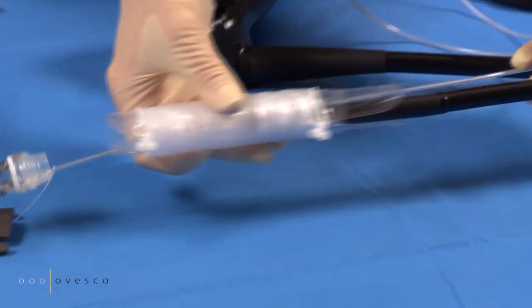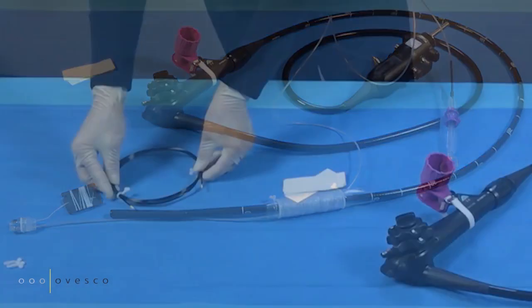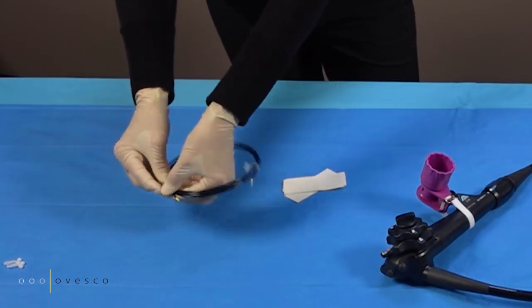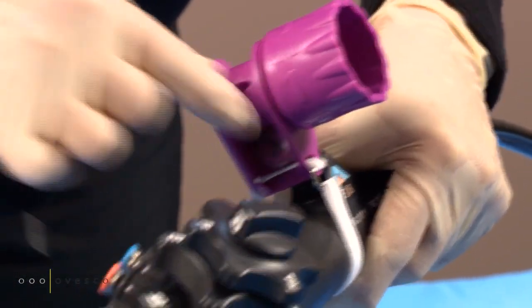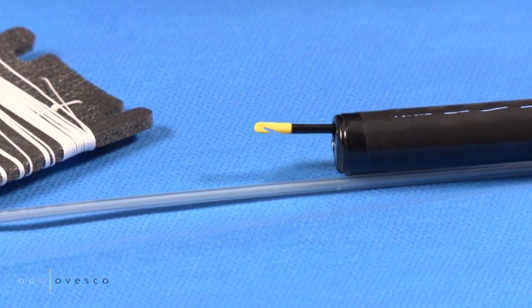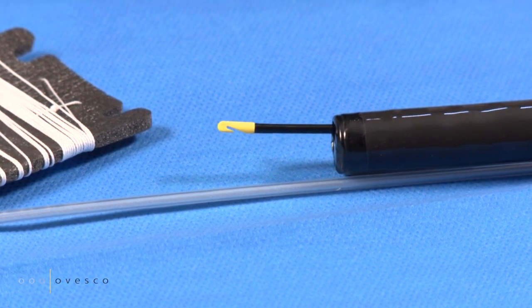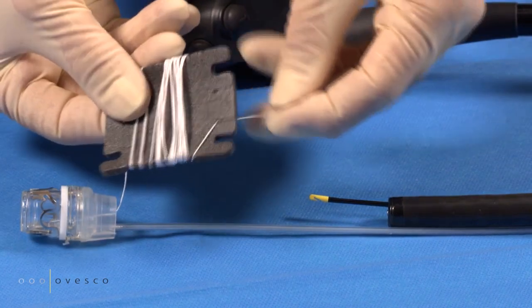Place the endoscope sleeve tube on the endoscope. Insert the thread retriever. Grasp the end of the thread and pull it through the channel.